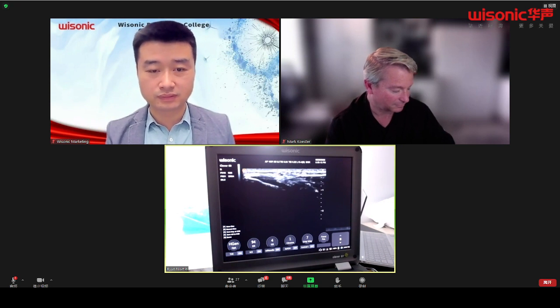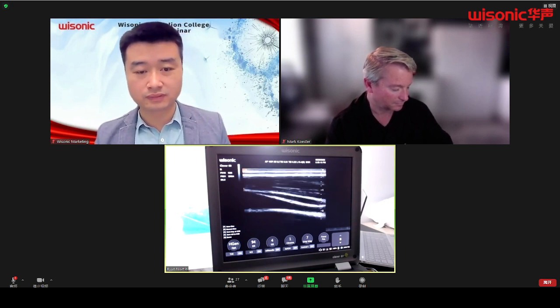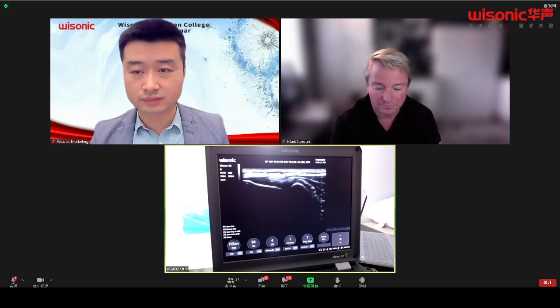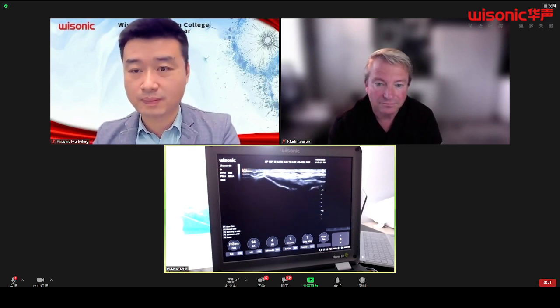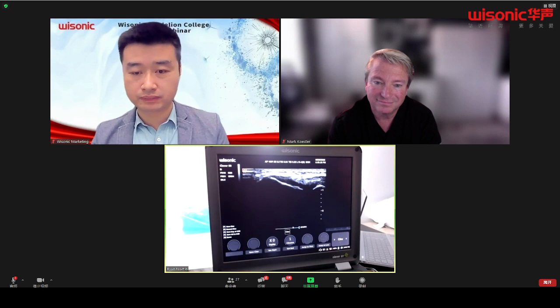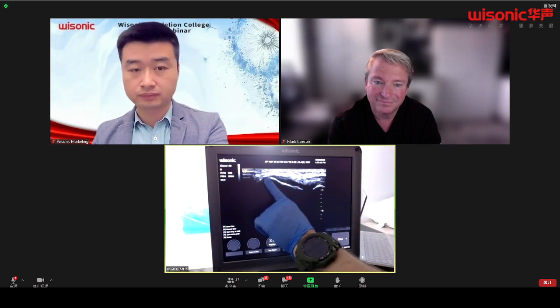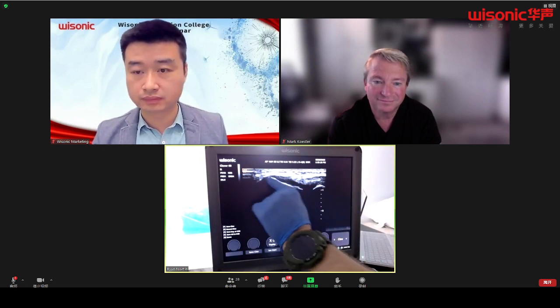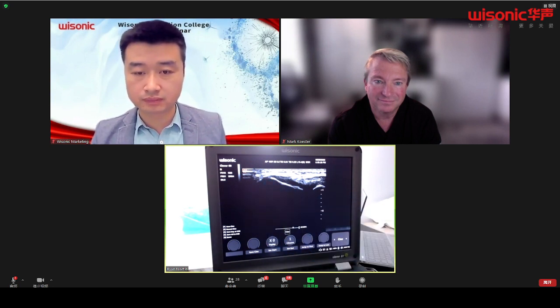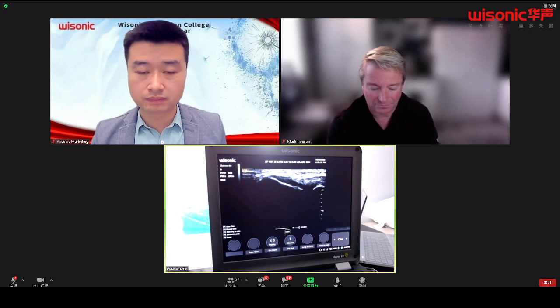What we're looking for in this area, obviously, is going to be any tears. We're looking for any type of enthesophytes. Now, if Tim doesn't mind, I'm going to show everybody what an enthesophyte looks like. So this little space right above here, right on that most apex of the epicondylar ridge, there's this small little enthesophyte, or a tiny little bone spur. It's incidental. It's nothing to go barking about, but it's there.